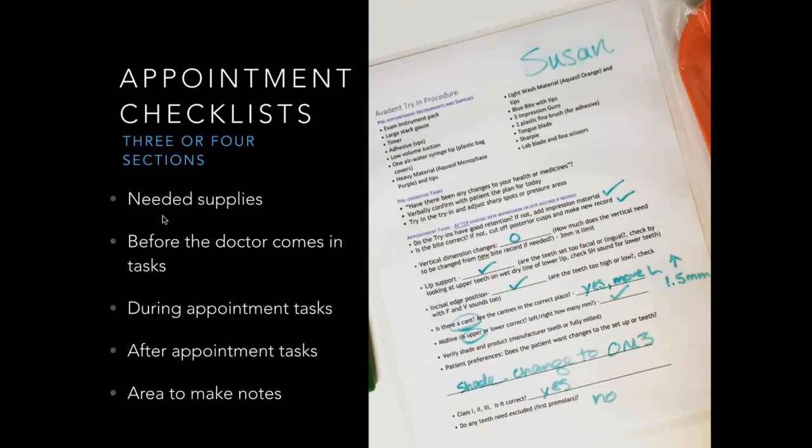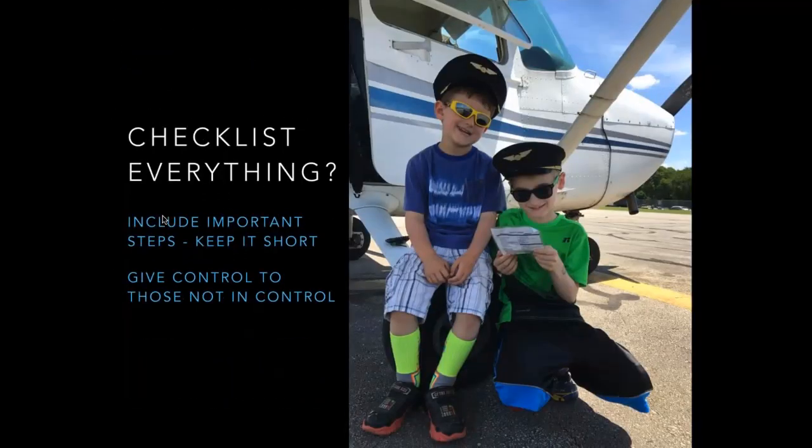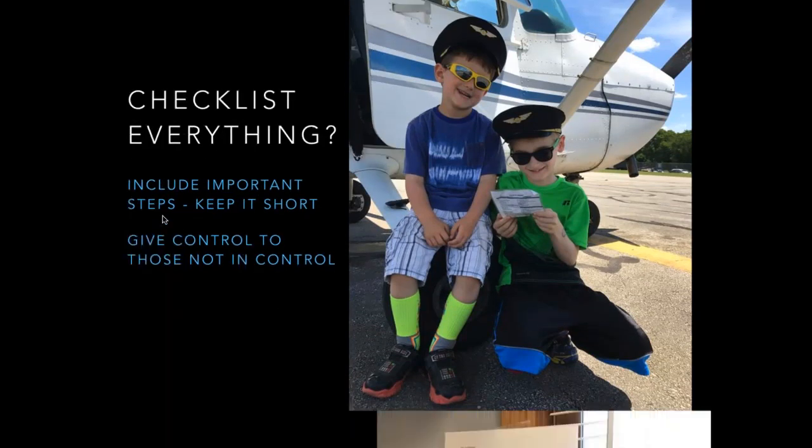Humans are naturally drawn to look at one or two details. So when you examine a digital denture try-in in your patient and you notice that the midline is off, oftentimes you will forget to look at the lip support. You will forget to check the vertical. So you have to be disciplined in going through a checklist to find all of these things, because humans tend to look at one thing. With a conventional try-in, you can keep trying that denture in until you get it right. But with digital, remember, you're trying to accelerate it and get to a final product sooner. So I do checklist everything. I teach checklists for everything that I do.